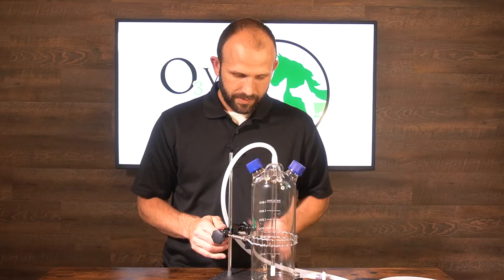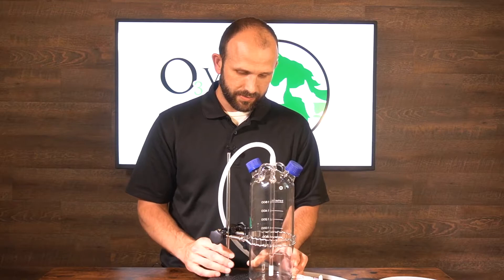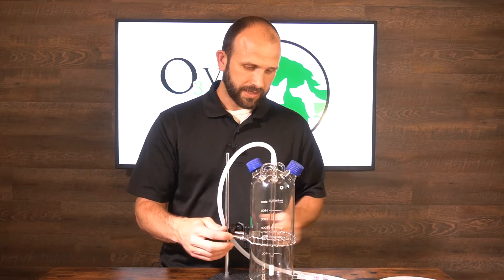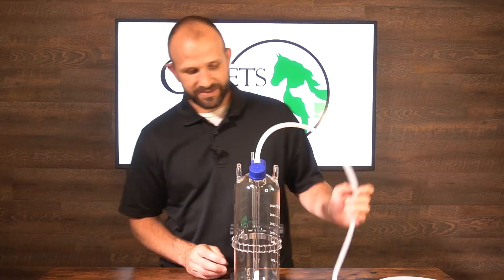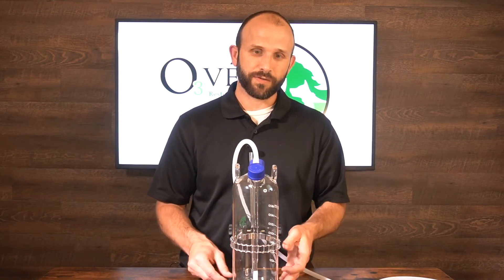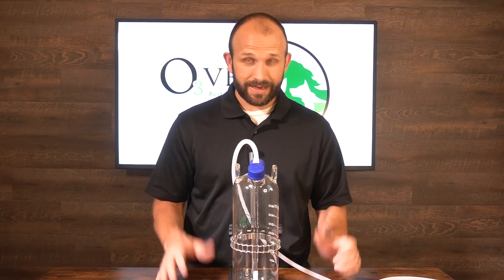Push the assembly back as far as it will go onto the plate, then tighten down the chain clamp so everything is nice and snug. That will keep the bubbler from tipping if anything knocks into it. That is the tabletop unit. Let's take a look at how to attach your bubbler to an IV pole.